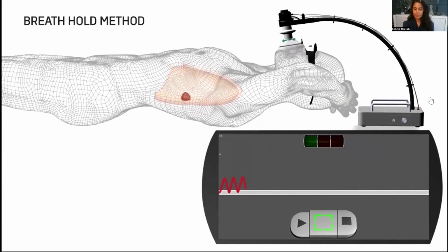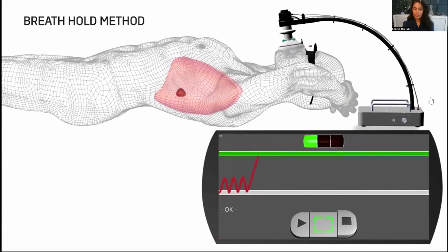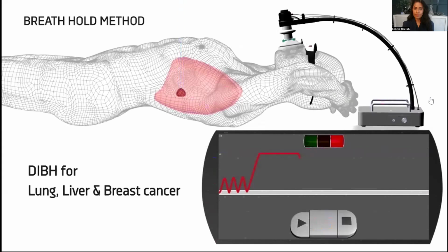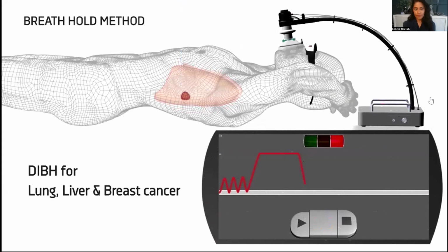Once you have achieved 3 consistent breath cycles, your therapist will ask you to take a slow, steady, deep breath in. This breath does not need to be excessively deep. Instead, take a very comfortable breath that you can hold for about 15 to 20 seconds. Remember, this is based on your own unique ability and allows your physician to create a personalized treatment plan specifically for your ability.